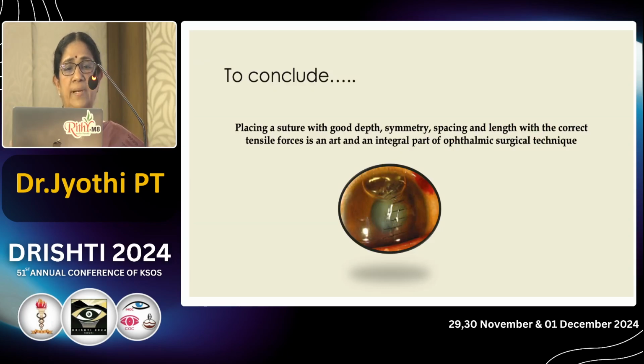And to conclude, placing a suture with good depth, symmetry, spacing and length with the correct tensile forces is an art and an integral part of ophthalmic surgical technique. Both a science and an art to get a good sutured globe.